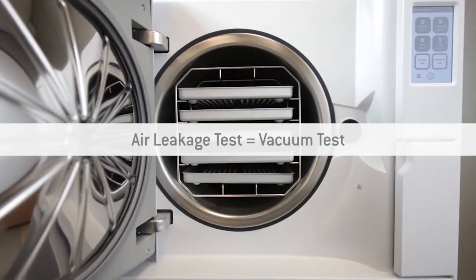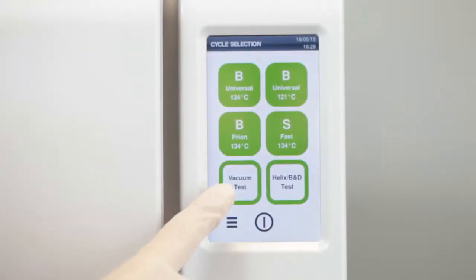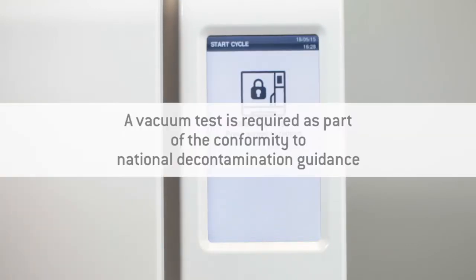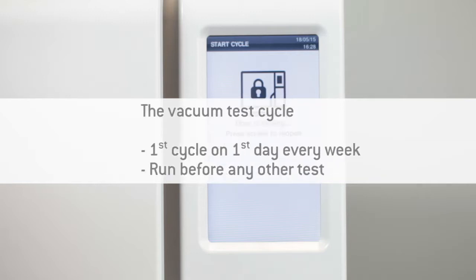The vacuum test can be found in the cycle selection screen. A vacuum test is required in accordance with the National Hygiene and Decontamination Guidelines. It tests the integrity of the Leaser sterilizer's closed pneumatic circuit and the vacuum pump performance. The vacuum test should be carried out before any other test, such as the helix test cycle or a normal cycle.